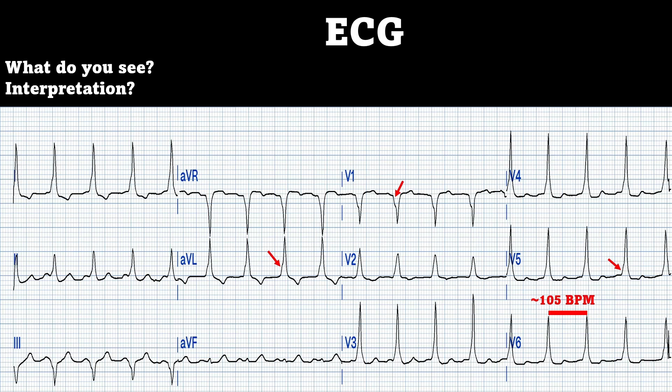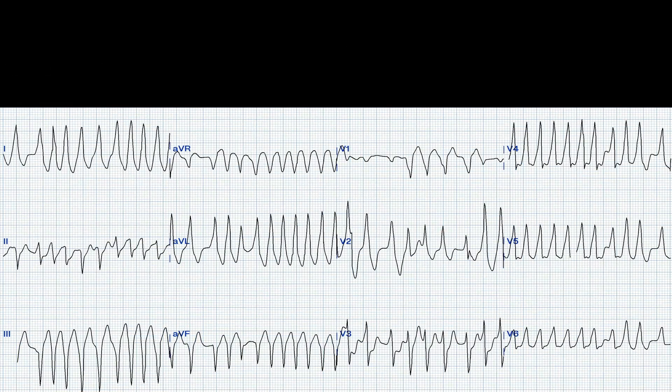While you're with the patient, the patient starts having some shortness of breath and some chest pain, so you get another 12-lead. This is what you see. Take a minute and see if you can break this one down.